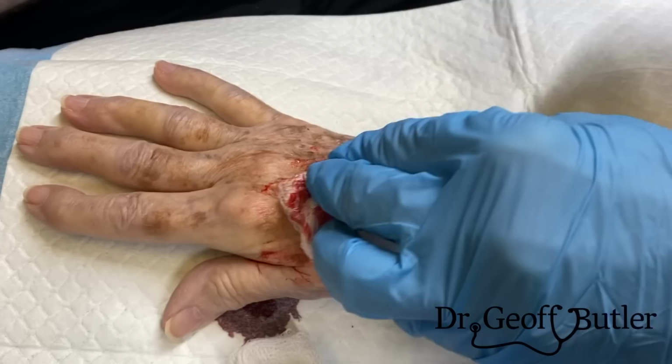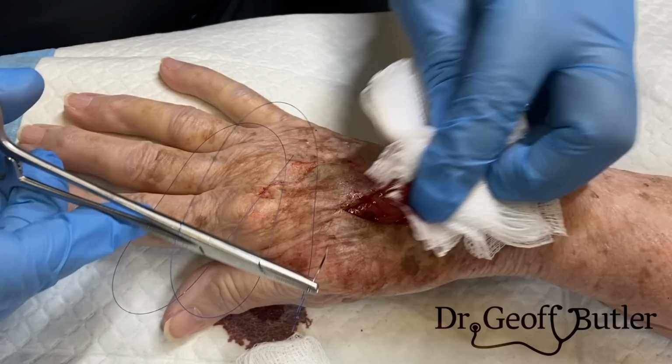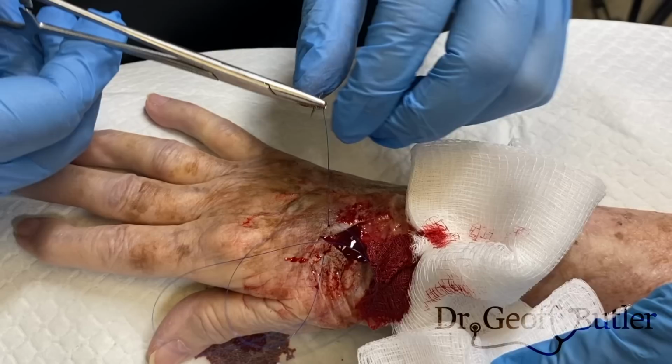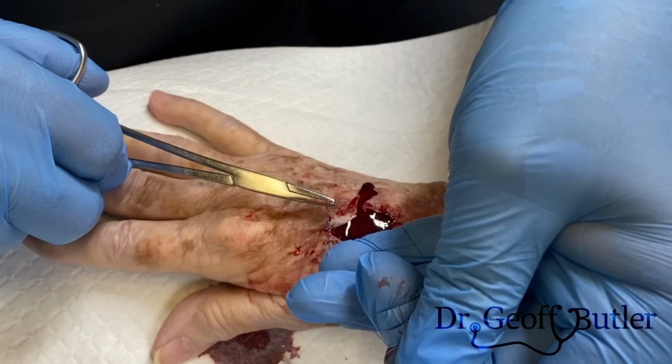So just from a practical standpoint, just release that for me. This is a small papillary that's bleeding here. That's not a lot of bleeding, even though it looks like it's a lot, and I won't even try to cauterize that. This is something that, if my stitch is in, we should be able to tamponade just with pressure. It probably won't be captured in this first one, I imagine. It's probably going to be in the second one.